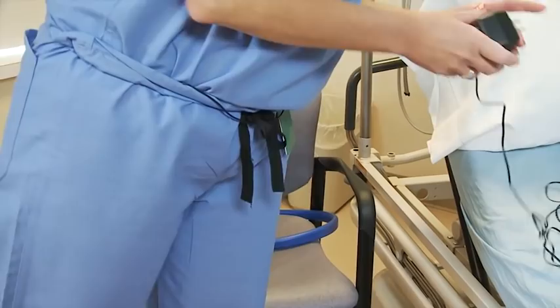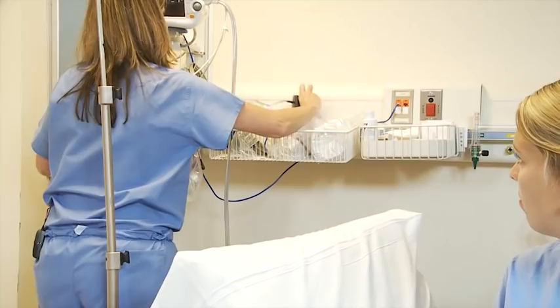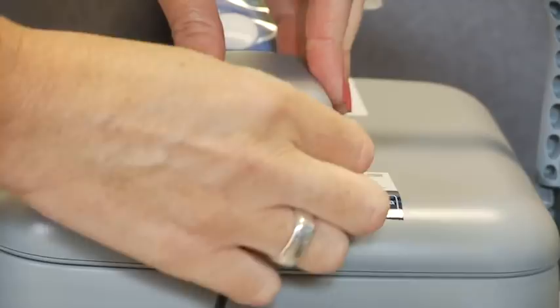Next you want to do is just plug it in. This is just a two-prong adapter. I'm going to plug into the wall. It's going to plug right into this area here where it says front. Once it's plugged in, it's automatically on. There's no on or off switch.